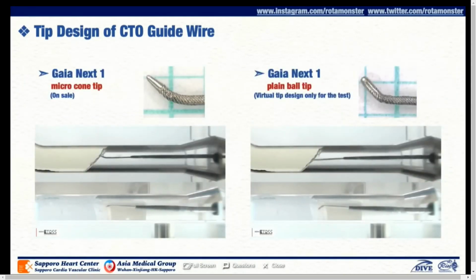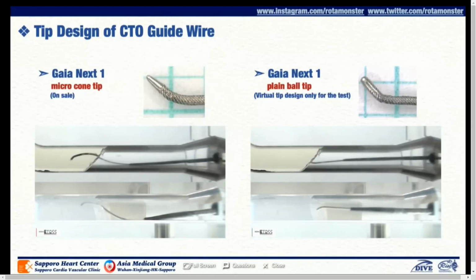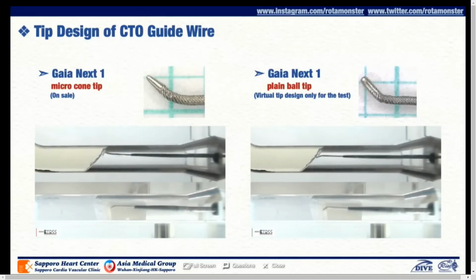The left image shows the Gaia Next 1 with a regular Microcone tip, and the right image shows the Gaia Next 1 with a ball tip. They were used for experiments on penetration of the proximal cap. Again, both are the same Gaia Next 1, except for the tip design.